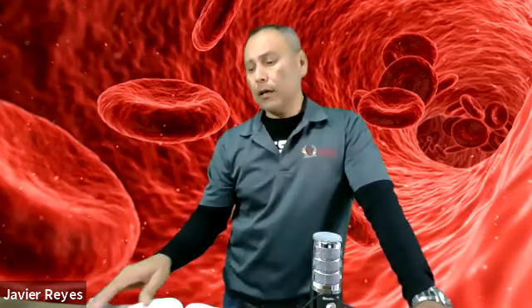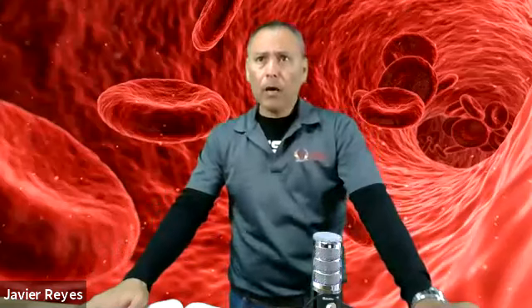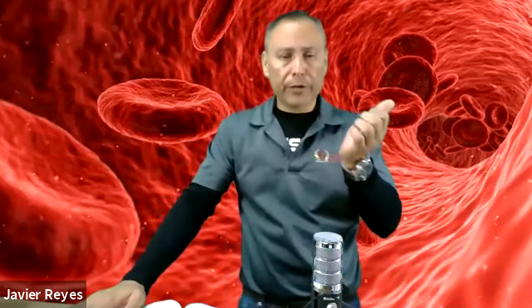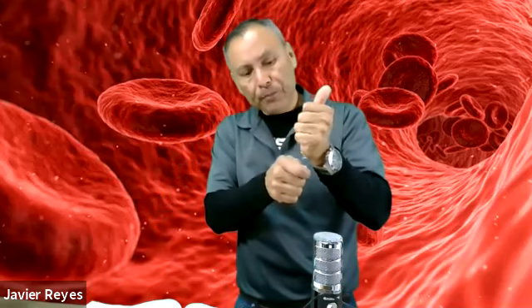Lay your forms on that area and they're contaminated, then your specimen is going to be contaminated. Now, the circles have to be filled completely, okay? So when you put the paper against the heel, make sure that you have a good blood flow. You don't want to go way over the circle. You want just enough to fill that little circle.